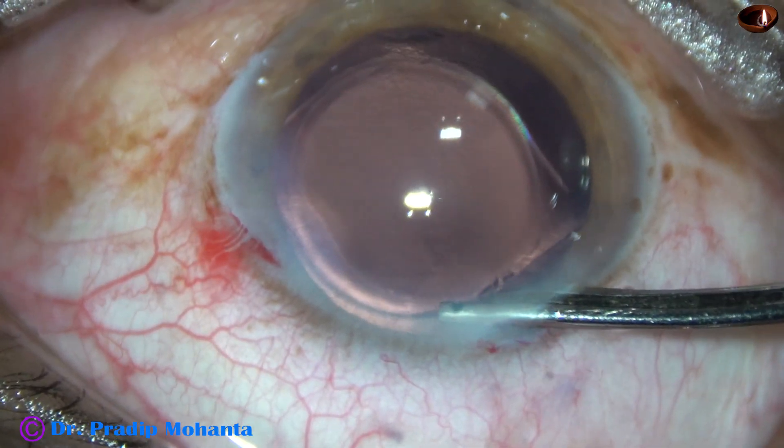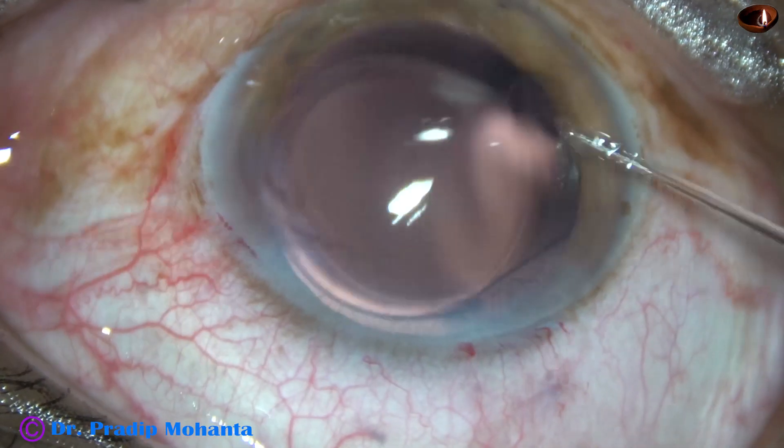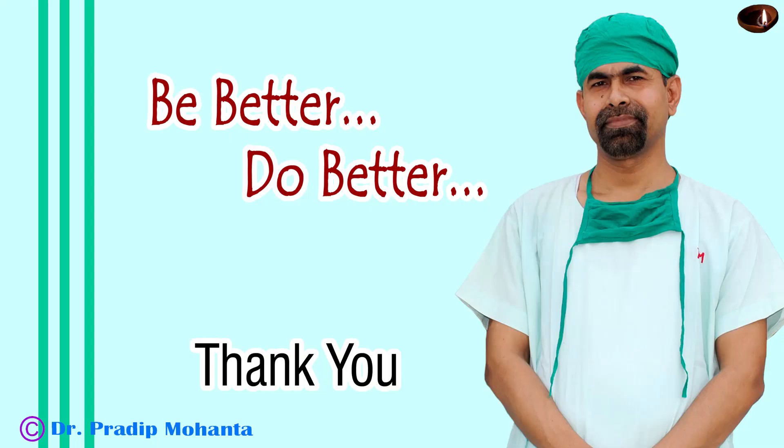This is the final lavage of the anterior chamber, checking the integrity of the wound. The case is concluded. Thank you very much for your attention. I hope this video will help you in developing your surgical skills. Please try this lens tilt technique in soft cataracts.